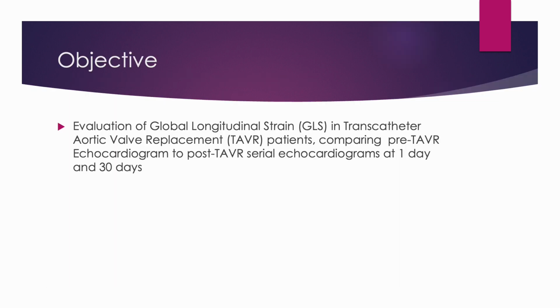Our objective in the study was to evaluate global longitudinal strain, or GLS, in transcatheter aortic valve replacement patients, also known as TAVR patients, comparing pre-TAVR echocardiogram to post-TAVR serial echocardiograms at 1 day and 30 days.